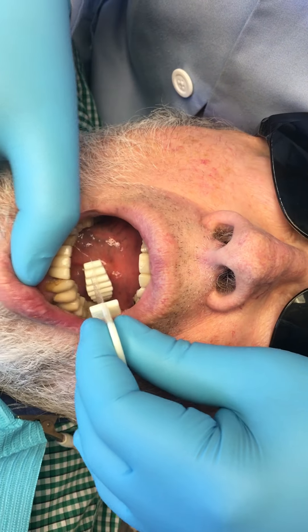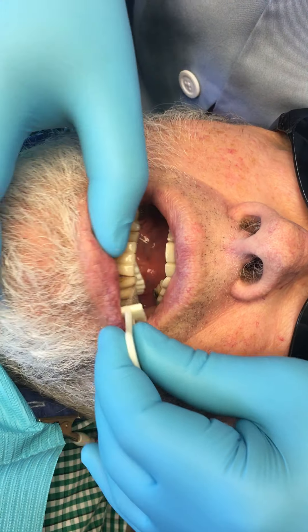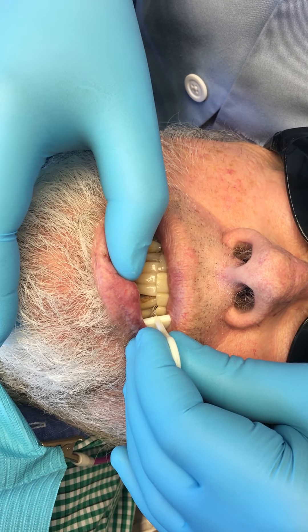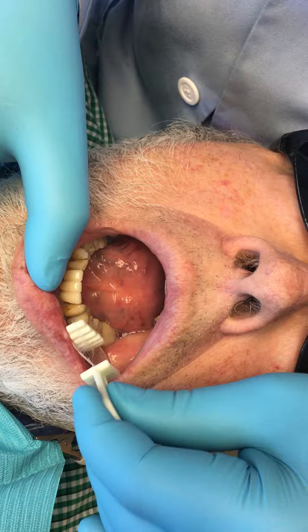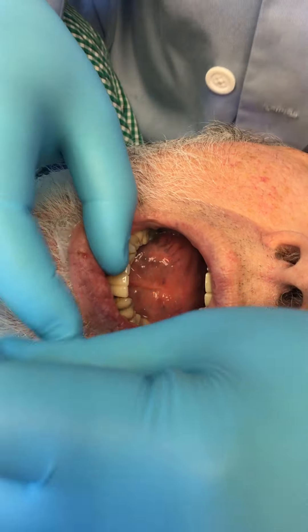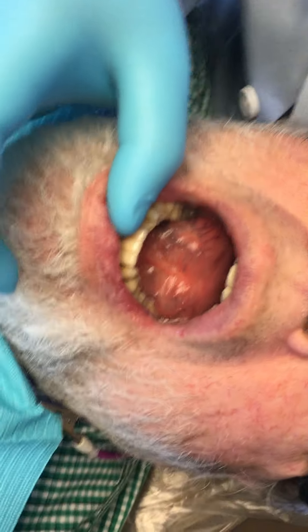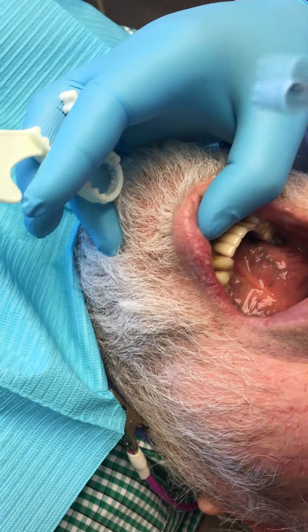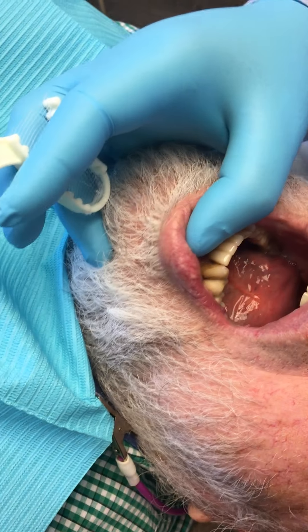Open, close, open. You're gonna close just like that. Open for me. I'll put this stuff in there — just one second — and then you're gonna close so I can take a template of your teeth.